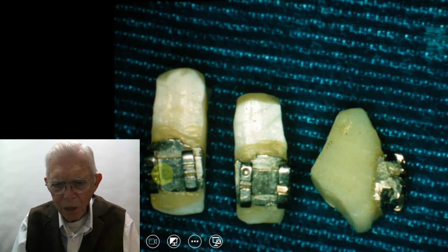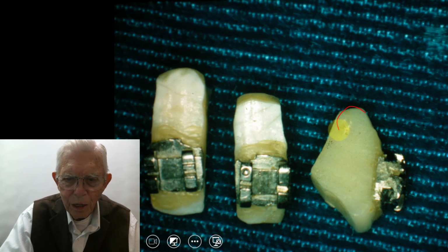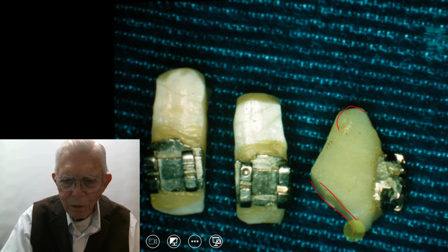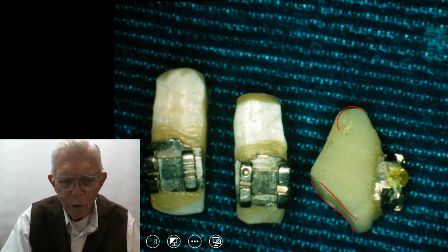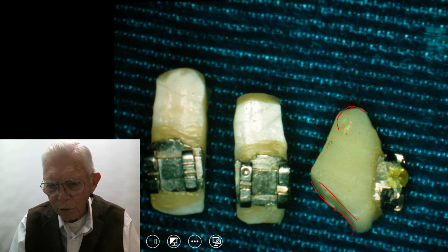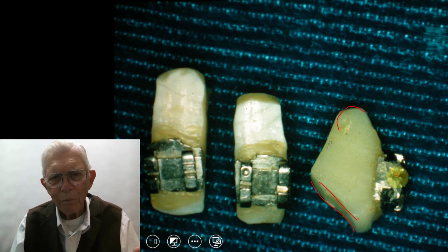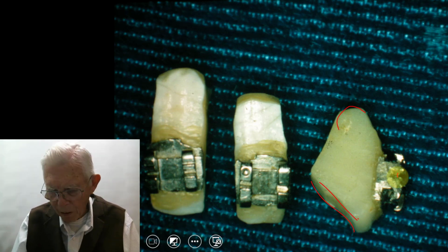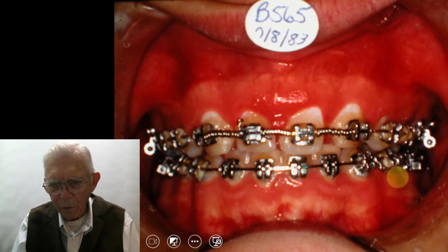And the teeth that we had, this was the incisal edge, and we just ground them off like this and hooked them onto the arch wire, and they would embed in the gum tissue to some extent and look like an actual tooth there. So that kind of helped the appearance of this thing as we went along. So let me go ahead and we'll show.